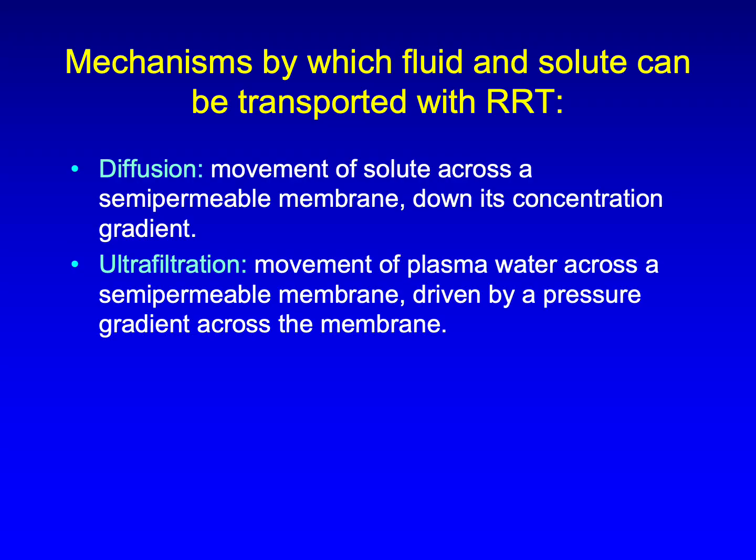Ultrafiltration is the movement of plasma water across a semi-permeable membrane driven by a pressure gradient across the membrane. You apply a negative pressure on the other side of the membrane and pull plasma and everything that is dissolved in it through the membrane pores.